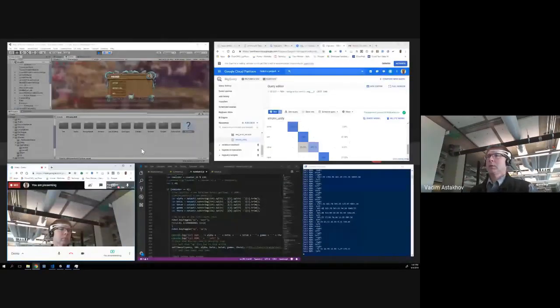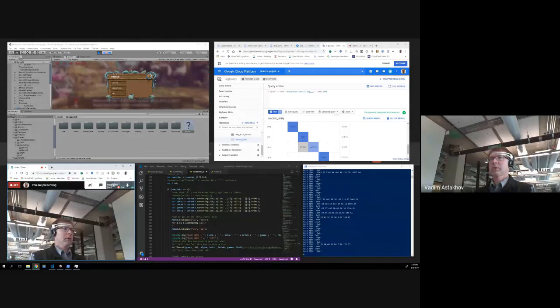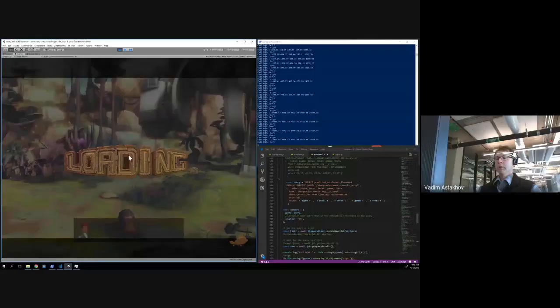Now I can quickly demonstrate how you can use this trained model to operate a brain-computer interface. As you can see, I trained it for very simple commands like push left, push right. Other means look around, jump, and some other things. Currently, I run my script and I prepared this gaming environment in Unity. Let's start and see how it goes. Let's see how I will be able to operate this avatar.